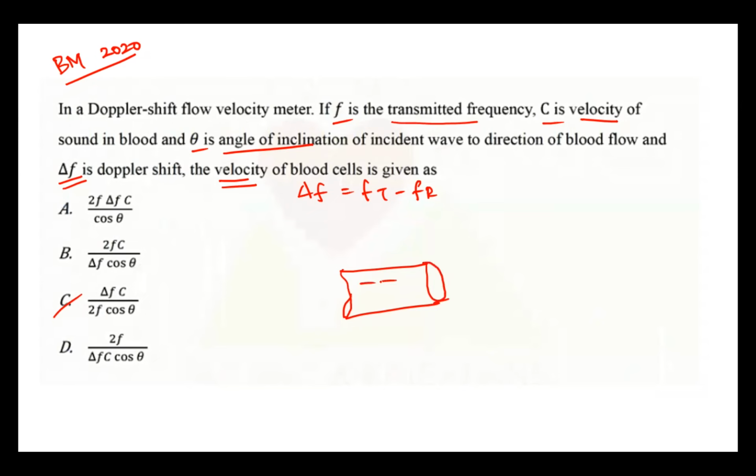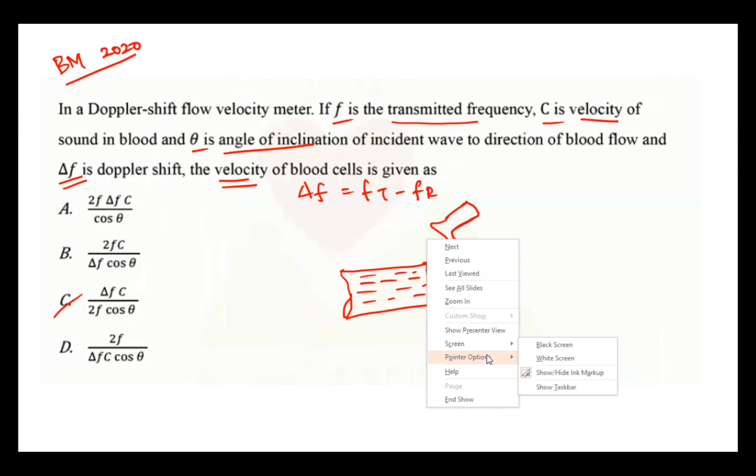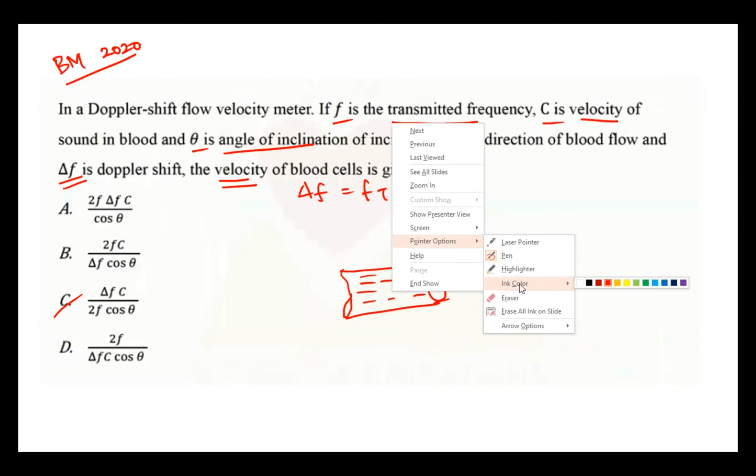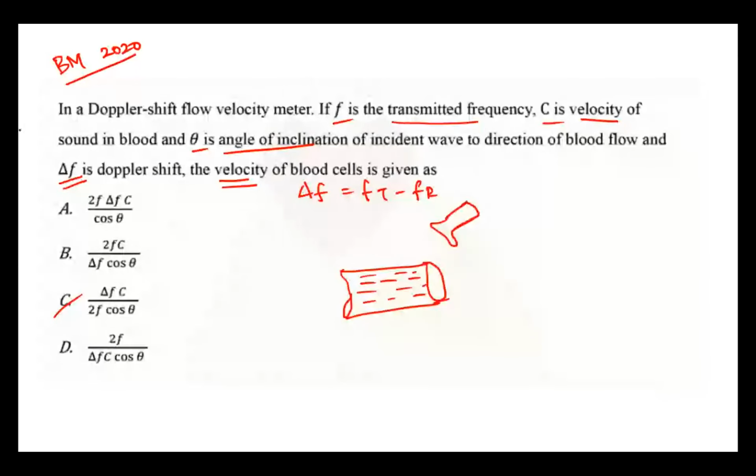Yes, we have a blood vessel here. We have blood flowing in the blood vessel. We have an ultrasound transducer. It transmits a signal and it receives a signal.